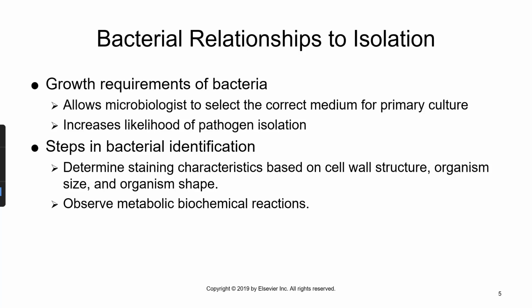If we know one bacterium can eat glucose but not lactose, and our patient specimen can eat glucose but not lactose, then we can say, oh, our patient specimen eats the same things as this known organism, and then we can deduce the identity of the microorganism. And we always correlate that with the Gram stain, with what it looks like on a plate, and with the patient's signs and symptoms.